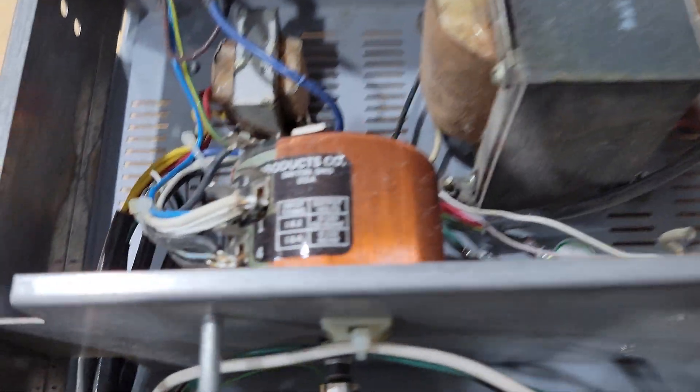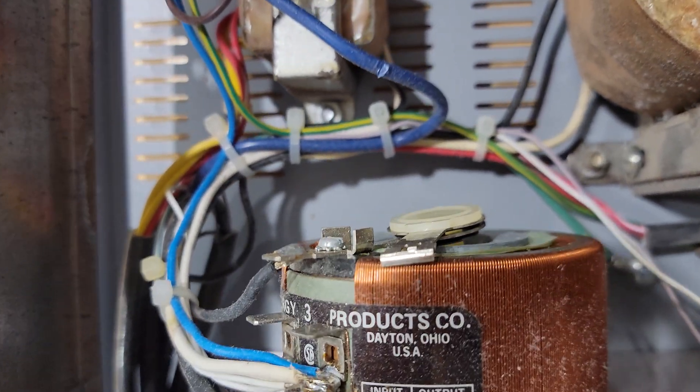That's the first thing I'm going to work on here. It's a simple mechanical repair — hopefully simple — just a matter of bending that piece of metal back into place.